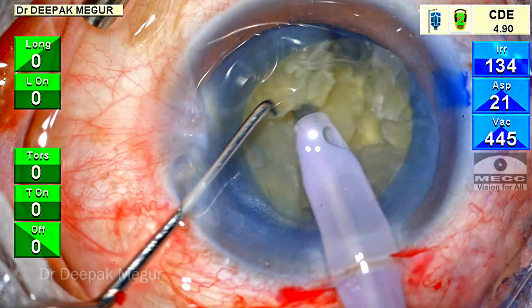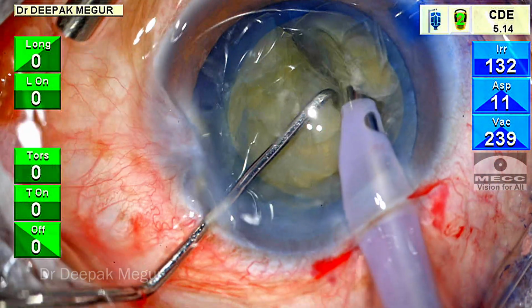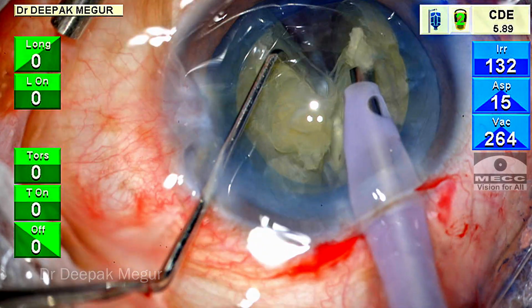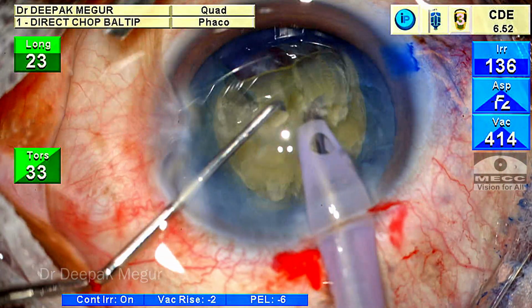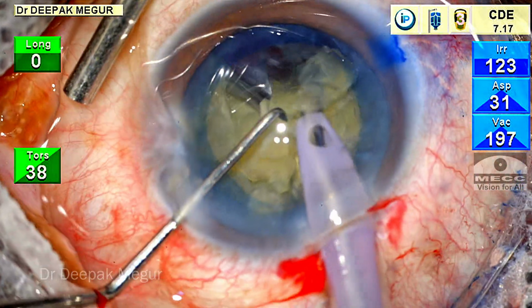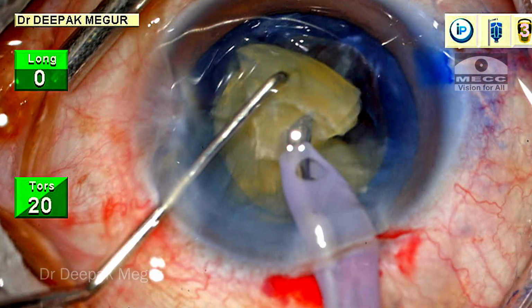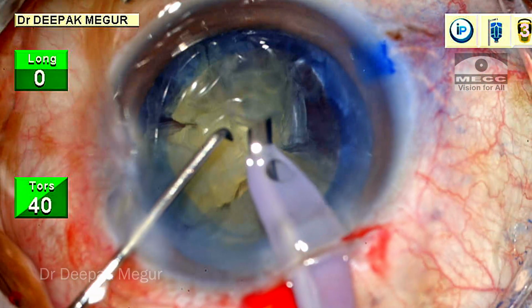The tip is buried again. The vertical chopper goes in to produce the third chop, and we have a free fragment ready. The chopping is continued. Now we have a free fragment which is pulled out of the bag and then is being emulsified. So far so good. Things are looking to be very much under control. The next fragment is held, pulled out of the bag and then emulsified. Things are looking as routine as it could be.